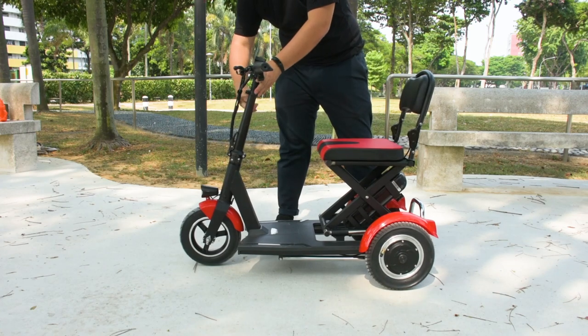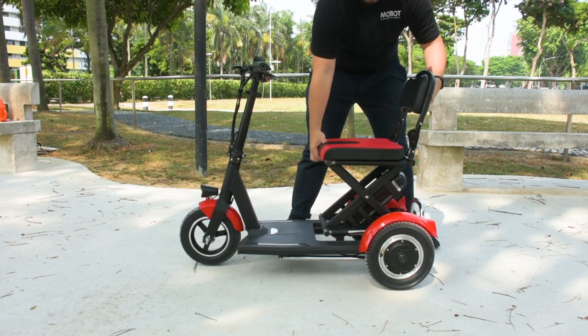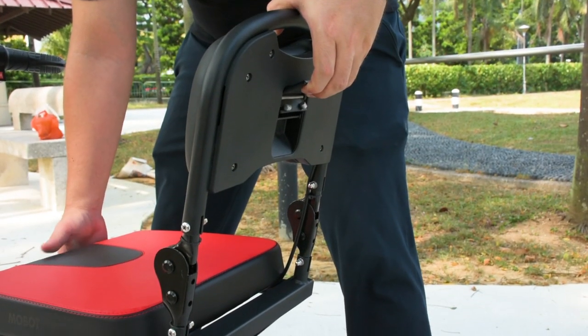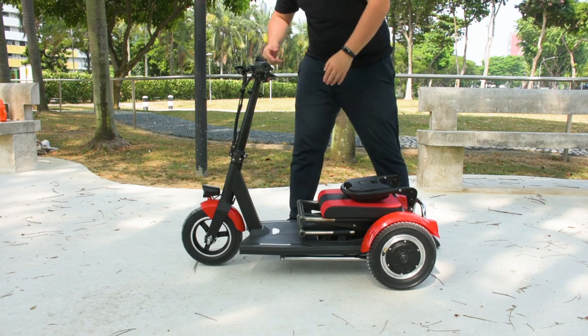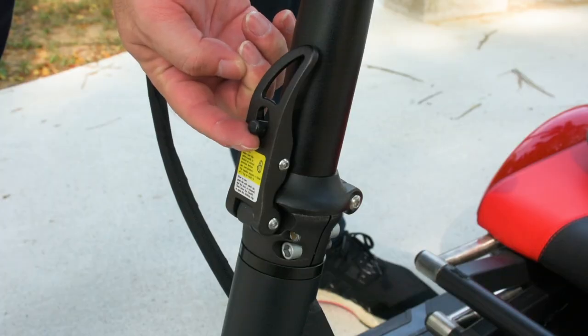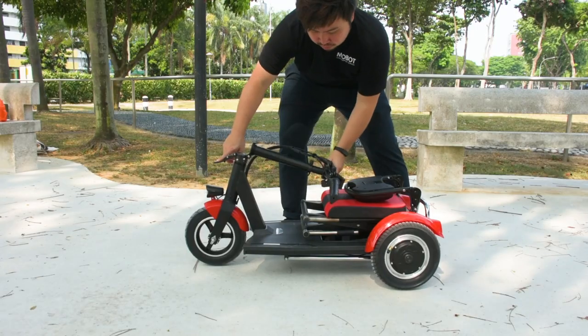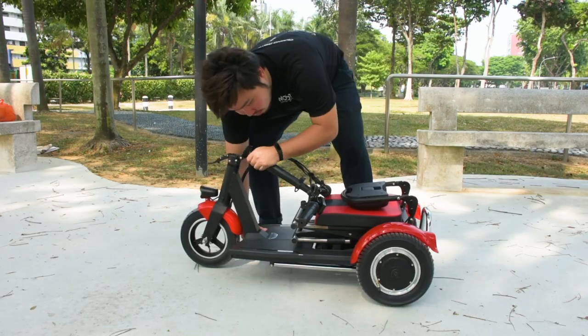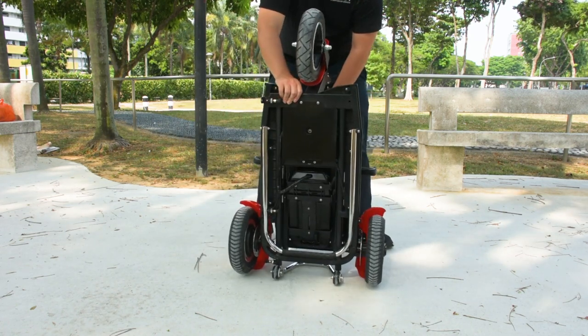First, retract the handle by releasing the lock. There is a latch behind the backrest that can be pulled to release the locking mechanism, which will allow you to fold down the seat. To fold the entire handle, there is another lock at the front which can be released by pushing up on the secondary lock, pulling the latch to unlock it, and folding down the handle.